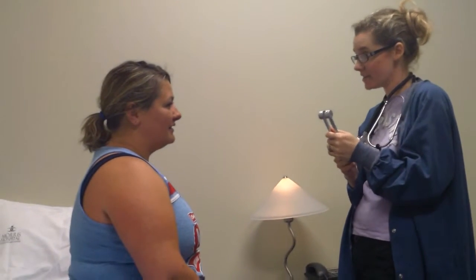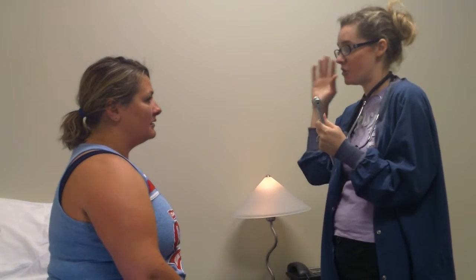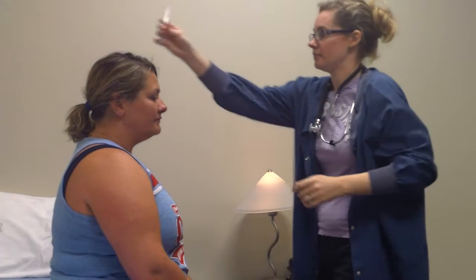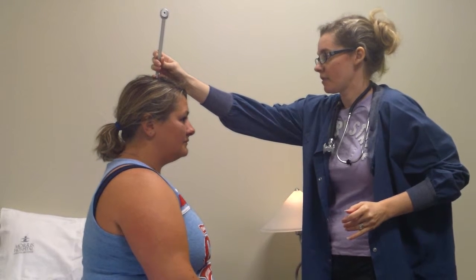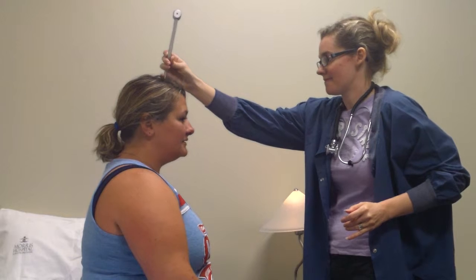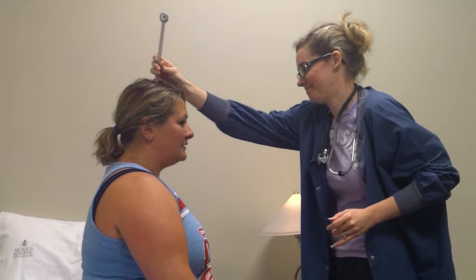I am also going to test doing the Weber test. I'm going to make this vibrate and put it on the top of your head, and I want you to tell me if you hear it in the right ear, the left ear, or both ears bilaterally. Left. You hear it in the left more than in the right? Mhm. Okay. Left. Usually you hear it bilaterally, but that's okay.